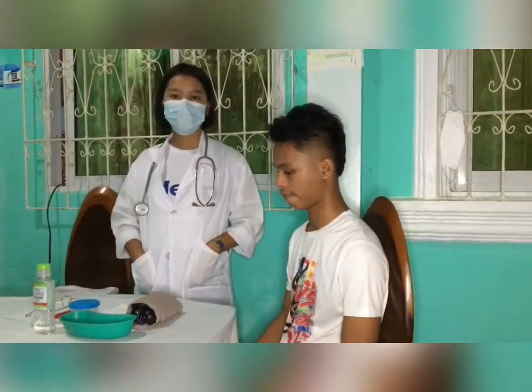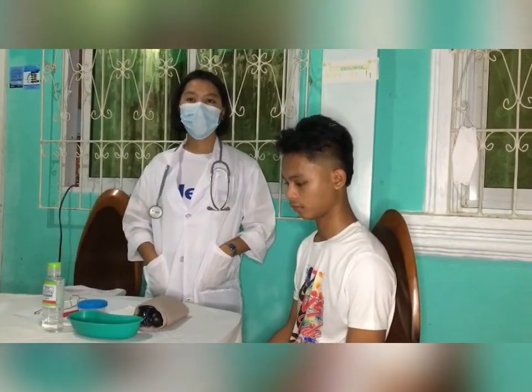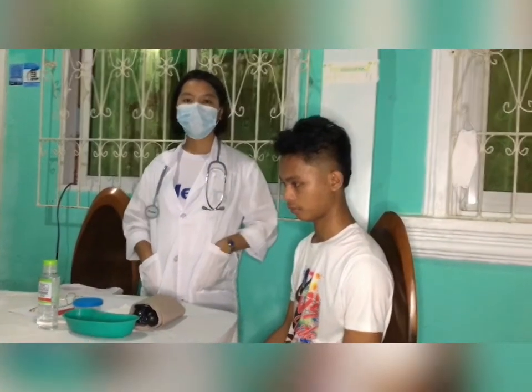Assessing blood pressure. Position the client appropriately and allow a 10 to 15 minute rest if the patient was engaged in a strenuous activity before BP assessment. In a sitting position with arms slightly flexed, the forearm is supported at heart level and facing up.